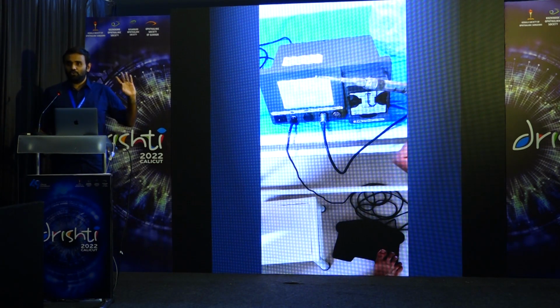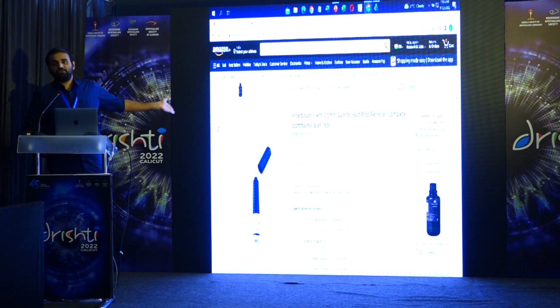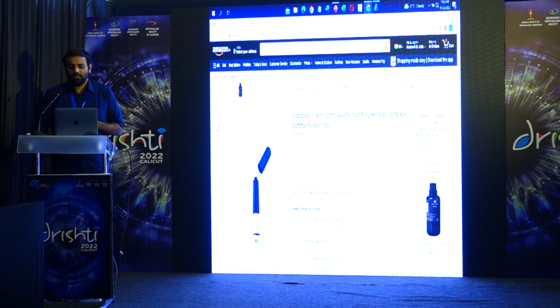Now if you don't have access to something like this, you have this which is available on Amazon. It's called the Alger brush. It's only about 7,000 rupees. It's battery operated. It's very easy to purchase. All of you can have it in your OTs.